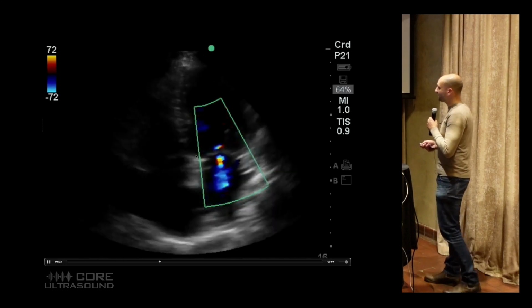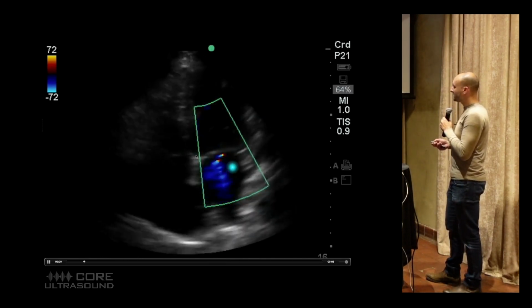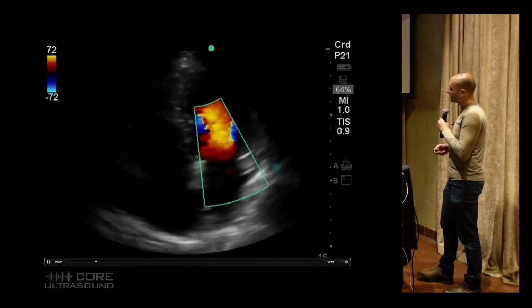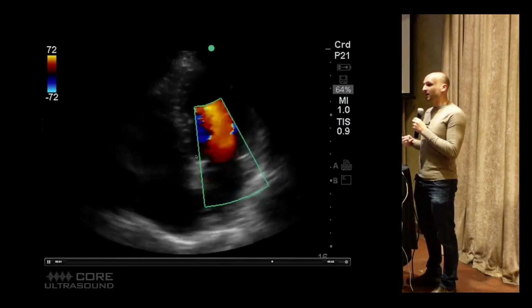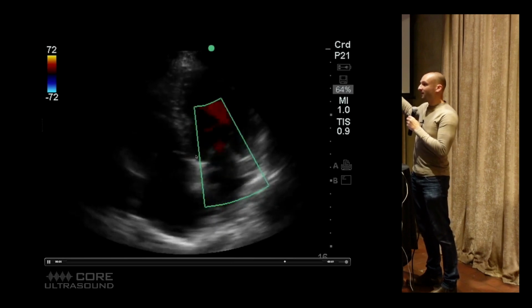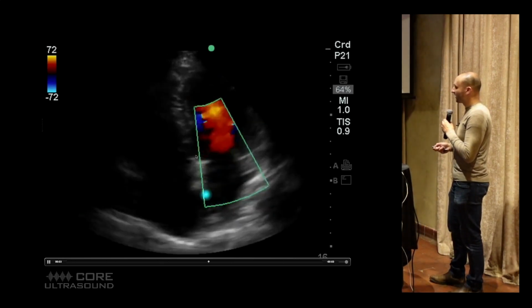Now I will say with the gate, I usually angle the gate a little more into the atrium to see more how the flow is moving around. You see that little arc dome thing right there? That's actually something that you can measure. The PISA method helps you figure out exactly what level of regurgitation that is, if you ever want to go to step 7 to figure that out. But for the most part, I'm putting this just in the ventricle to see how big that flow is.